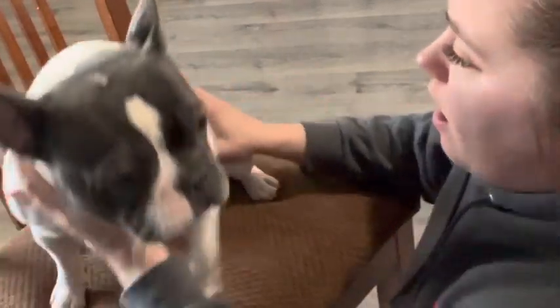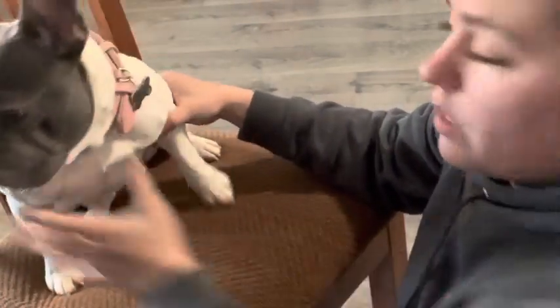Okay, so today I'm going to show you how to do a blood draw. This is Dahlia. I hope the video is in the right spot, okay.